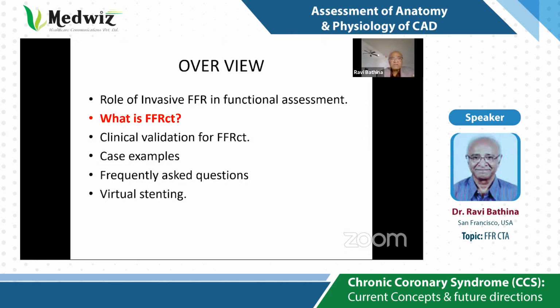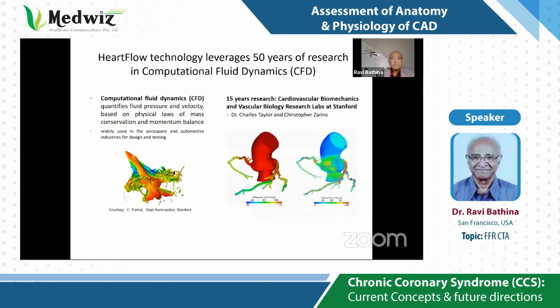What is this non-invasive FFR CT? Well, it is based on physics that has been around for almost half a century: the physics of fluid dynamics. On top of that, they added computational fluid dynamics, which quantifies fluid pressure and velocity based on physical laws such as mass conservation.